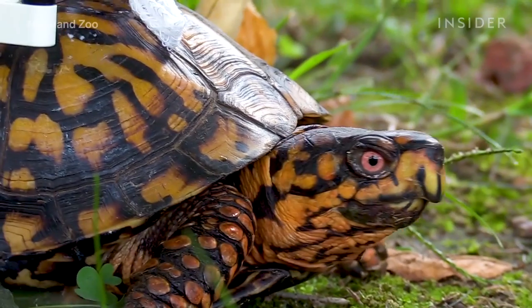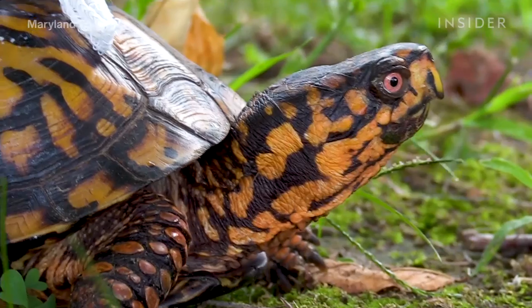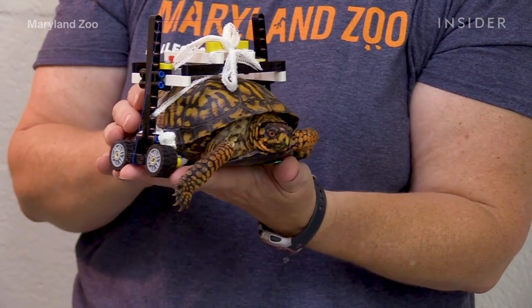We were discussing in our medical rounds that he needed to be elevated off the ground, and we were thinking of ways we could do that. They kind of gave it to me as a project to brainstorm all the ideas of what could work for him, and that's how I settled on the Lego wheelchair.